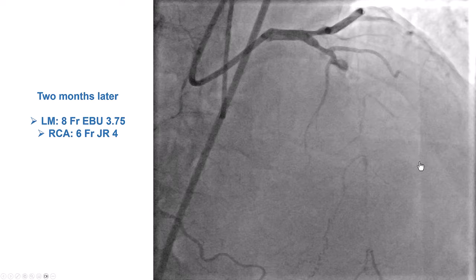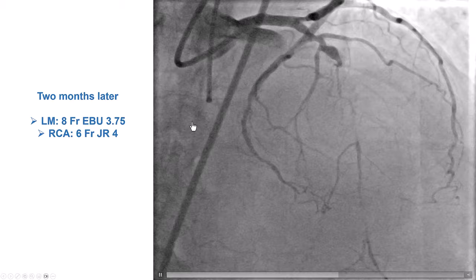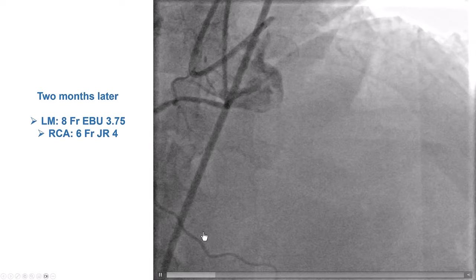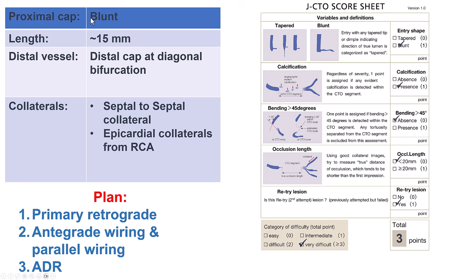The patient continued to have symptoms and returned two months later for a second attempt. This time we used an 8 French EBU-3.75 guide for strong support, and also a radial 6 French for the right coronary artery, because we thought it was unlikely we would go retrograde from the epicardial collateral coming from the marginal branch. We had a relatively short CTO but with a blunt cap and heavy calcification, a distal cap at the bifurcation of the diagonal, and a septal-to-septal plus an epicardial collateral from the RCA. Given the previous antegrade failure and a JCTO score of 3, we planned a primary retrograde approach through the septal-to-septal collateral.